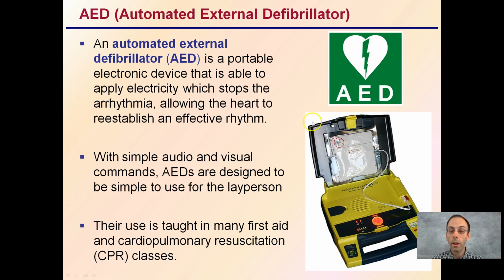So if you've gone to one of those classes, you may have had experience with these, but they are in very public areas, and they do walk you through the process in a very stepwise sequence. So you may be familiar with these, and this is a way we could restart the heart if someone did have a potential heart issue in a public area.